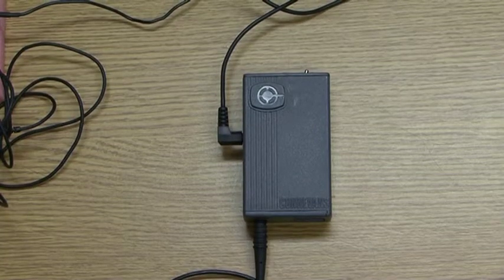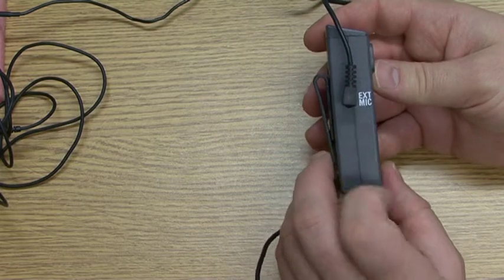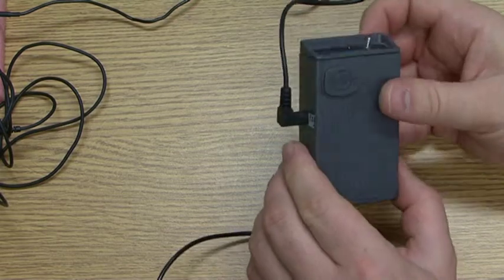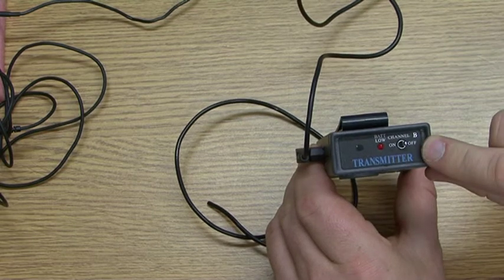Looking at the transmitter, on the side is the external microphone socket connected to the lapel microphone. Looking at the top of the transmitter, the channel letter needs to match the receiver, which is B in this case.